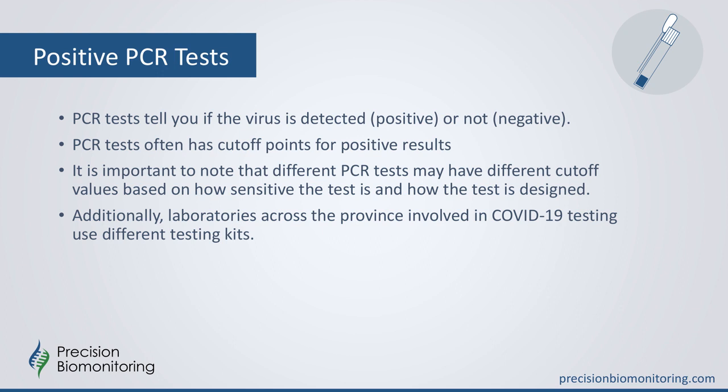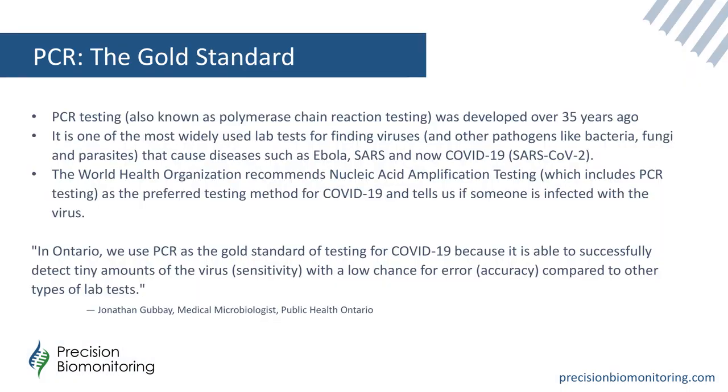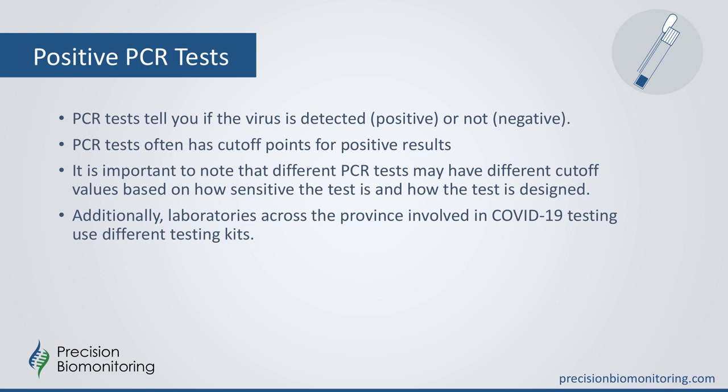So with that in mind, it's important to note that different PCR tests would have different cutoff values, and that might be based on how sensitive the test is, how it's been designed, the type of validation that was done. So it's really important to follow the instructions for use for those particular cutoffs, and provide feedback on that based on your testing as well. And there's laboratories across the province and country that use different testing kits. So there are different tests available to test for COVID-19.